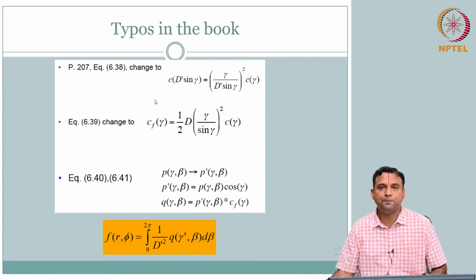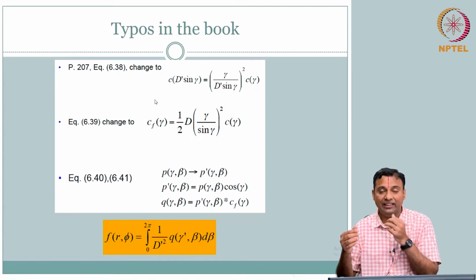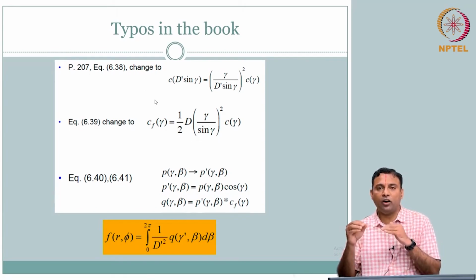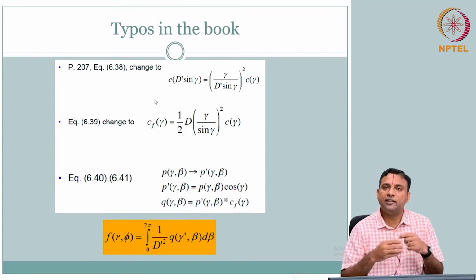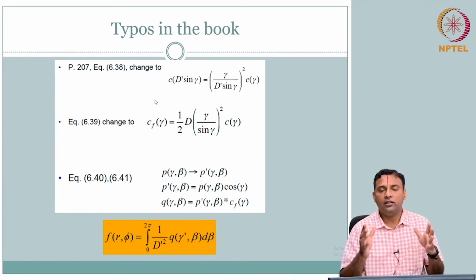So this is our major topic of recon, which is beautiful material. I hope you appreciate it. When we started, we had this projection, and the question was how we are going to get the image. Without flooding with theories or complex mathematics, intuition and common sense got us to back projection as an option. After that, mathematical correctness told us that there is a filtering term that should come. So when they talk about recon, the basic recon algorithms are here. We have covered it.